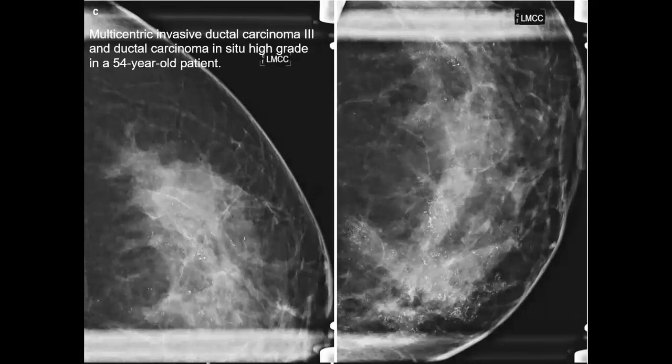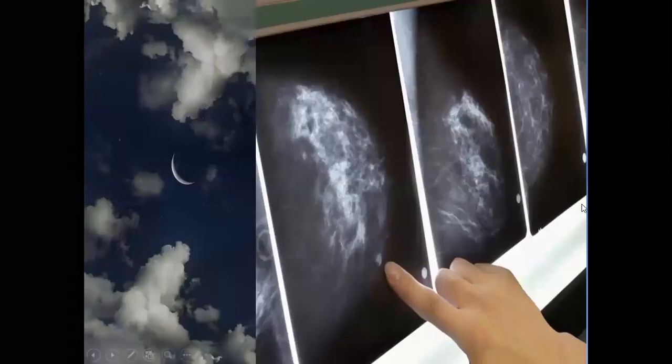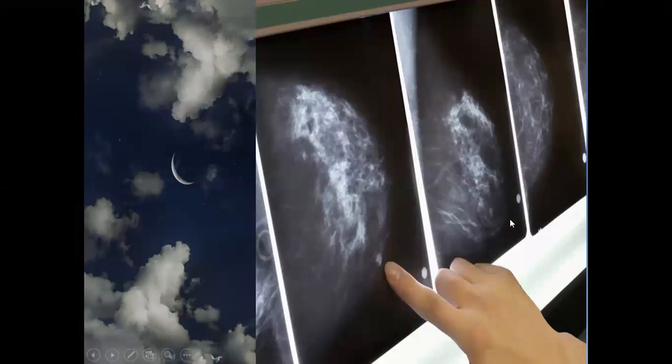You see, it's diagnosed in this dense mammography. And if you look here, this regular screening mammography demonstrates developing asymmetry in a case of early detected invasive cancer, and the patient is lucky. Why? As the cancer is evolving in a fatty area, like this small moon coming in the clear area in this cloudy sky.